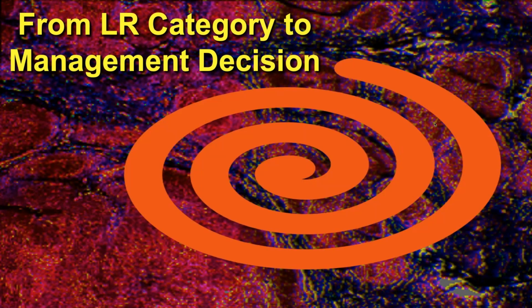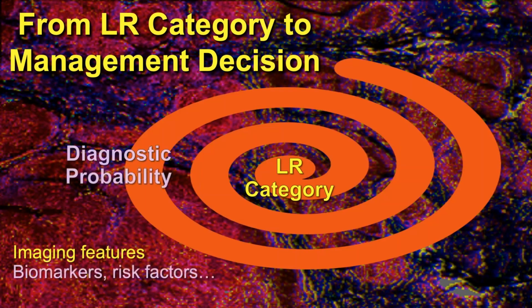There's additional information that has a big impact. So the important thing at the beginning is to analyze the imaging features using the very clear definitions that have been expressed in LI-RADS to recognize the diagnostic signs for a given observation and use them to assign a LI-RADS category. So the LI-RADS category is based on the imaging features. And the LI-RADS category relates to the probability of hepatocellular cancer or to other malignancies, but it isn't the sole determinant of that probability. So for example, if a patient has a LI-RADS 3 lesion, intermediate probability, but has an alpha-fetoprotein of 2000, it's probably hepatocellular cancer.